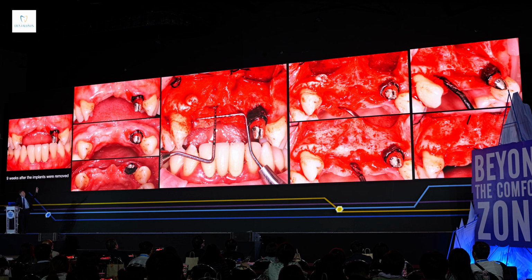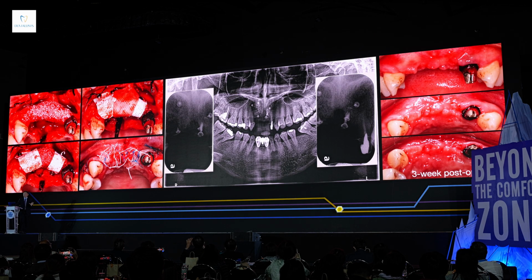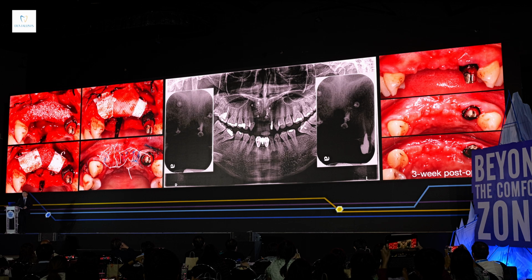If you look at the defect, those two implant sites are quite active. But the site next to the extraction site had an atrophic ridge. So in order to do the augmentation, I used a hybrid approach, which means I combine non-resorbable membrane and resorbable membrane. For the center, where there's higher healing potential, I use a resorbable membrane, while on the side I use a non-resorbable membrane. Why is that? Because the extraction site presented very fast healing, so I don't need a strong material to hold out the space, while those sites that have been atrophic for a long time do need to be held up.